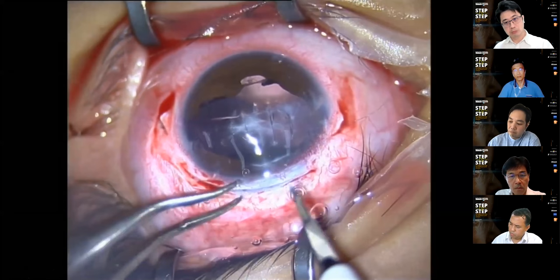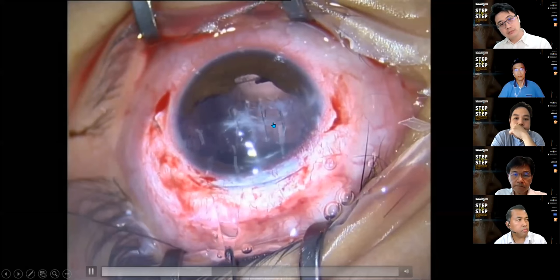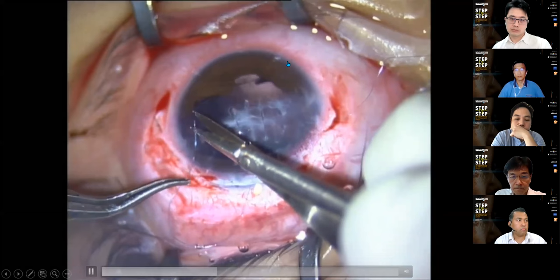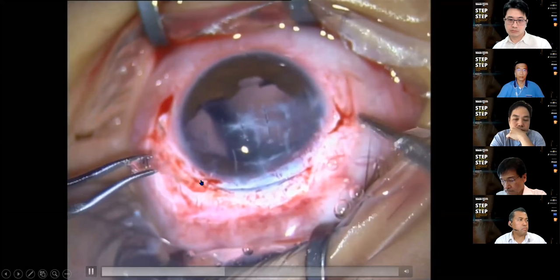So this is a 2-point fixation of a scleral flap. Then I will enlarge it to prepare for insertion of the IOL. Then I will externalize this suture. One thing, if you do a sutured scleral fixation, you must always orientate yourself. This end belongs to which side of the flap. It's very important, otherwise your suture will get tangled within the eye. So now I orientate myself. This end belongs to this side and this end belongs to this side.